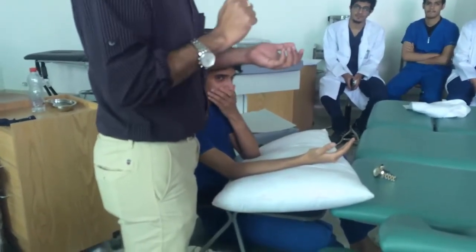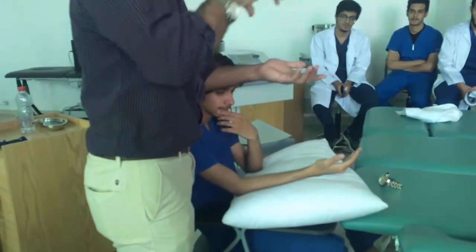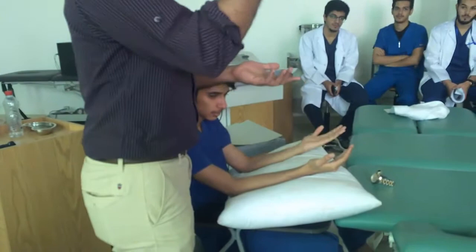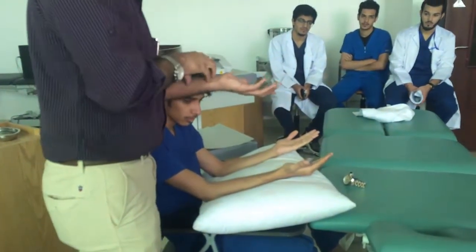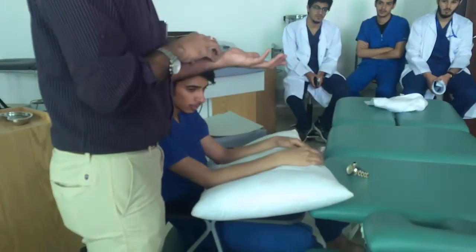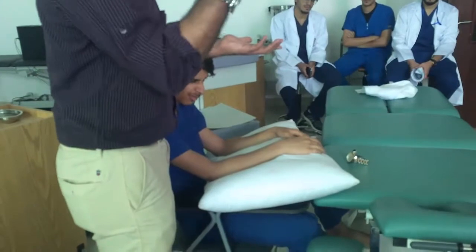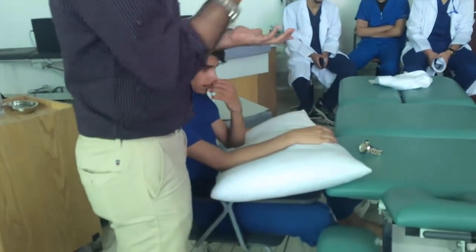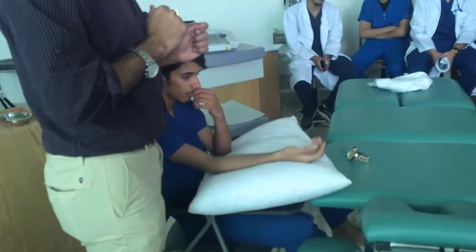First you should explain, I am giving this laser. This laser is helpful like this. This laser or light comes which goes inside your skin, inside your cells. It absorbs the light. Okay? It heals, it kills the bacteria, virus. It heals your wound. So we should explain to the patient. Understood what I am talking?